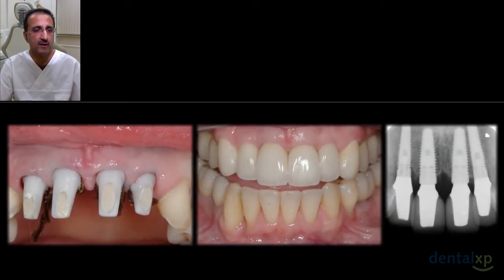Of course, always place a cord whenever you're cementing onto implant abutments to ensure that cement doesn't travel apically, and protect the transmucosal seal from cement ingress. And this is essential and mandatory for any cemented restoration on implants. Double zero cord, gently packed around each of the abutments, and then the crowns can be cemented.